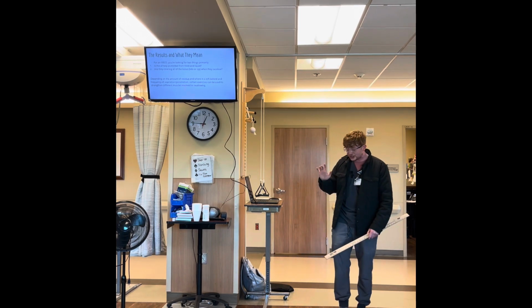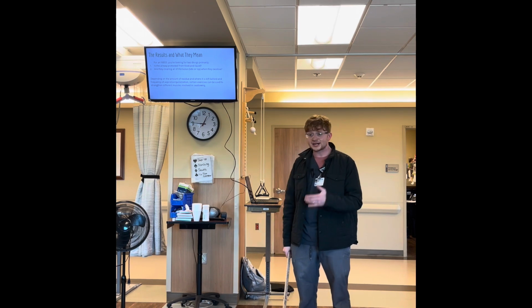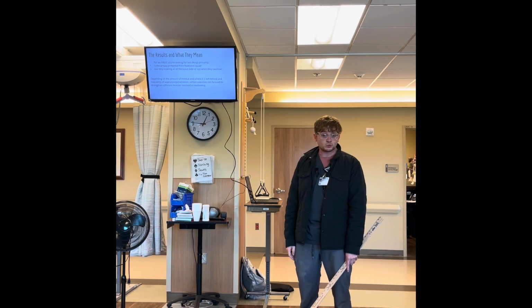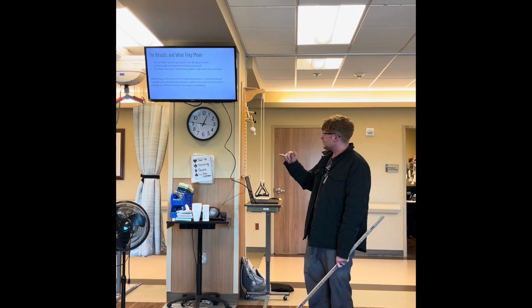And then after that, it's an interesting test, because unlike the other X-ray imaging, we can actually go through the results as soon as they're done. And they tend to enjoy that because there's no waiting. So we can go through the images with them.